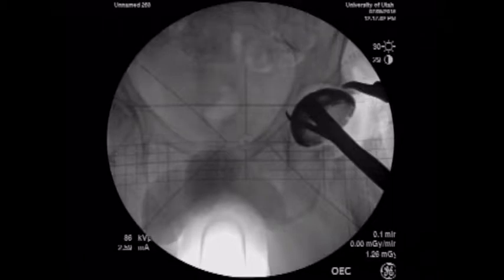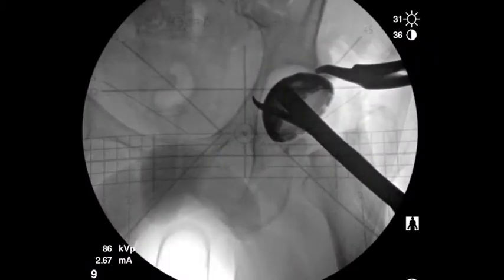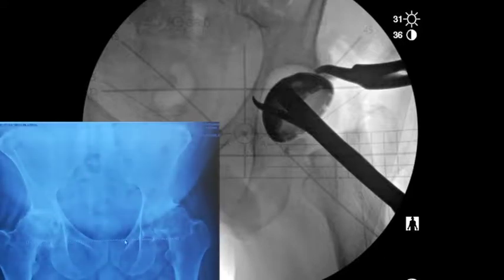I reamed a little high in him, which I knew would happen because he's eroded some bone up top, you know. In this case, I'm looking at the grid. For this one, I've slid the grid over toward this cup as a check of my cup position by placing the grid just so that I can see the teardrop on the other side and I can see the teardrop on this side. My trans-teardrop line is lined up with the teardrops, and I can see that I've adjusted his inlet-outlet or his pelvic tilt such that that line is above the top of the symphysis. Again, roughly about the same height, if I move this up to the trans-teardrops, as it was here. And I've simulated that position with my fluoroscopy for my tilt.